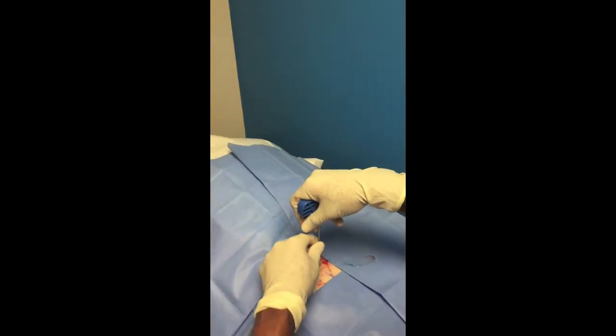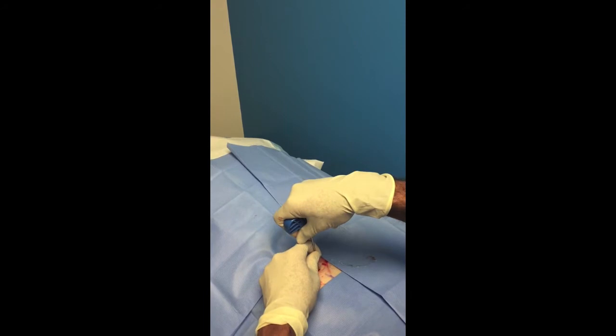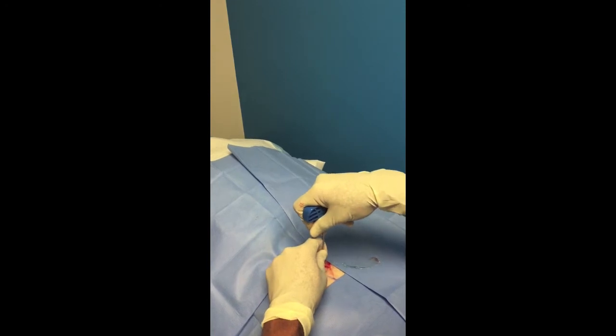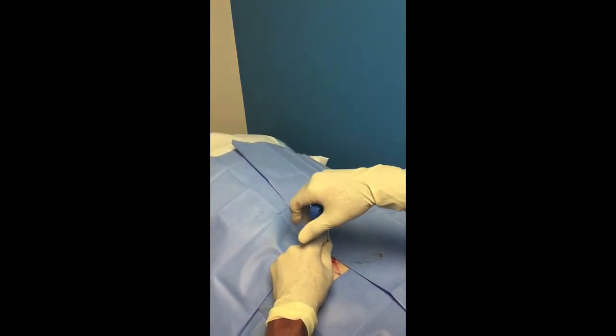So right there, I'm on the bone. Now I'm just trying to feel it medial — there's right over the middle. There's coming off the edge lateral. So if I'm right there, okay, you can stop videoing sometimes.